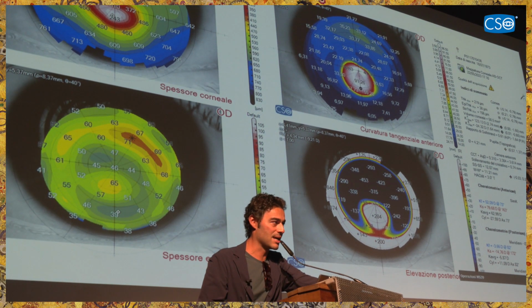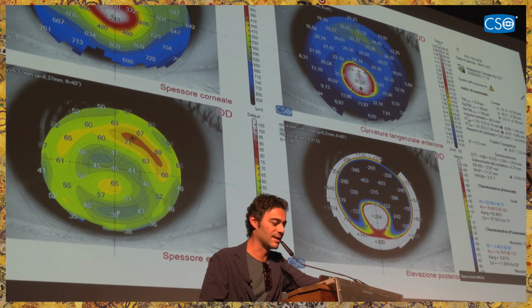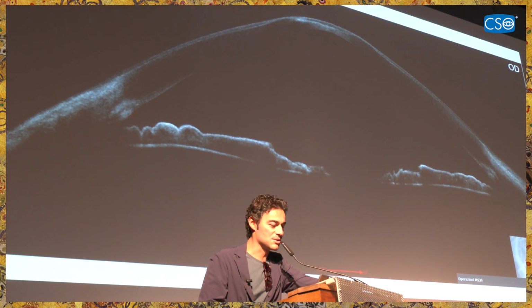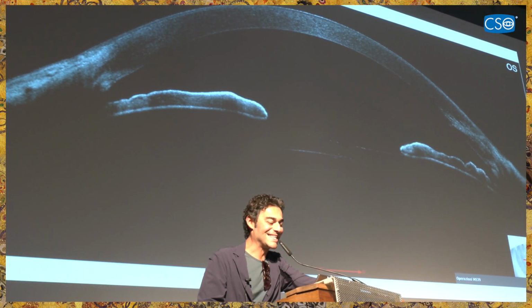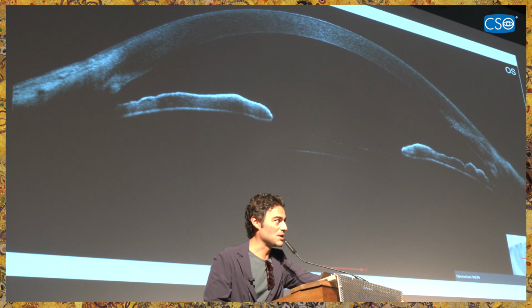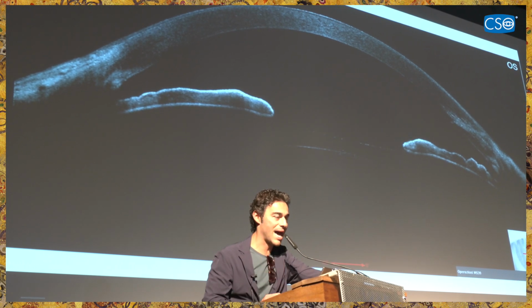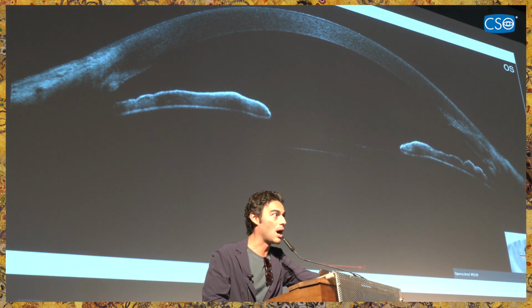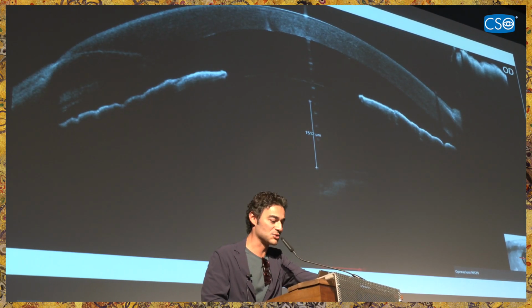So keratoconic eyes are definitely outliers. And this is another similar case. Of course, this is an extreme keratoconus. So we didn't go ahead for the right eye, but we did for the left eye. And these are the OCT scans. In the right eye, we had, of course, some scarring. We didn't go ahead with surgery. And in the left eye, as you can see, another outlier. So please pay attention to keratoconic eyes because they have a different anatomy in the eye, and probably also they have a different deformability. Think about the collagen modification in these eyes. So it's a topic to be better studied and better understood.